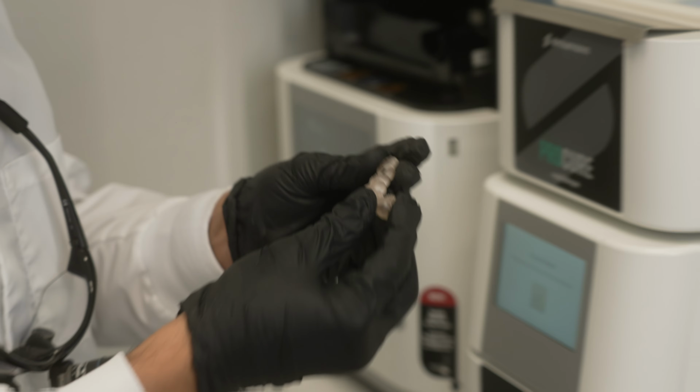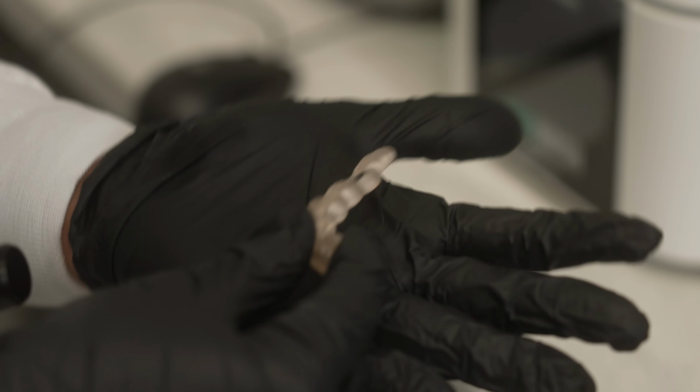So what are some of the fundamentals of 3D printing? Well, 3D printing is an additive manufacturing process, and we've gotten to a point where now we can do this in-house in the dental clinic. What we mean by additive is instead of taking a stone cast model, removing a section of it and trying to fit the tooth and the implant position into that, we can now slowly through the process, through a combination of the computer talking to the 3D printer, add the material and build up to just have the smallest footprint of a guide, which allows us to place the implant comfortably and within the confines of the oral cavity.